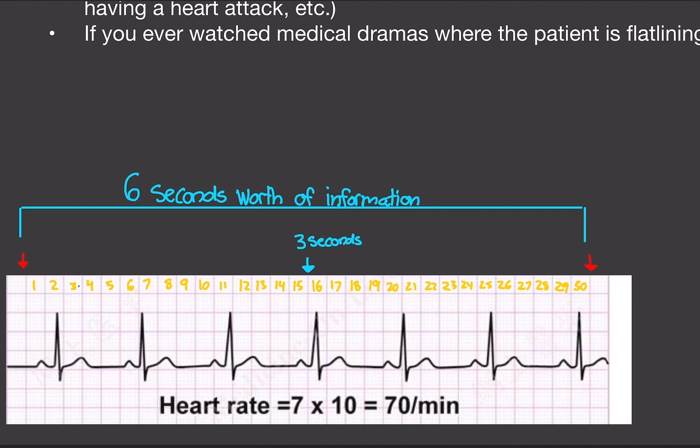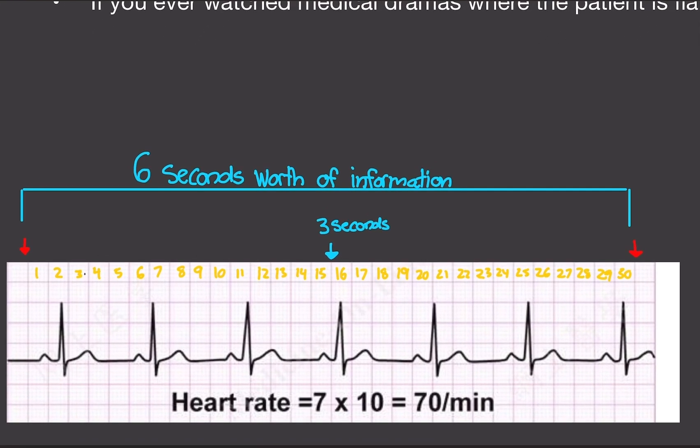This is a six-second strip — the ECG machine prints a strip in six seconds. Notice we have 30 boxes. What you do is you see the first spike and start counting the boxes all the way to 30. 30 boxes equals six seconds. Halfway, or 15 boxes, would be three seconds. If this is a six-second strip, if you multiply it by 10, it would become a 60-second strip.